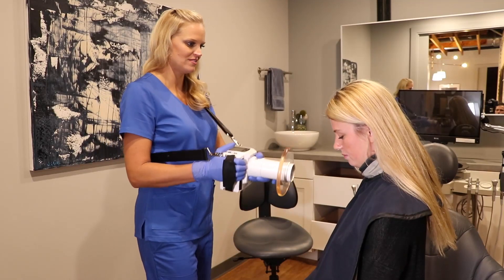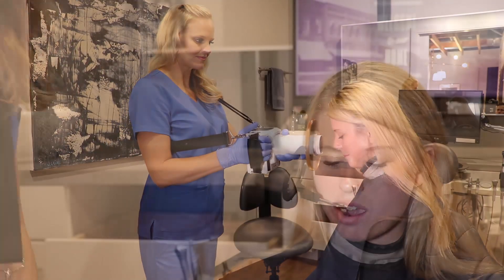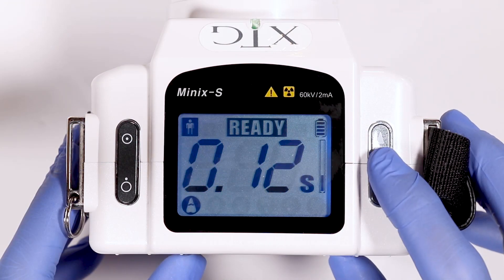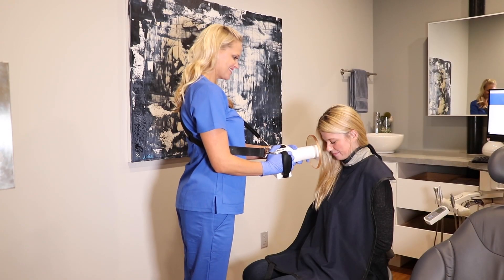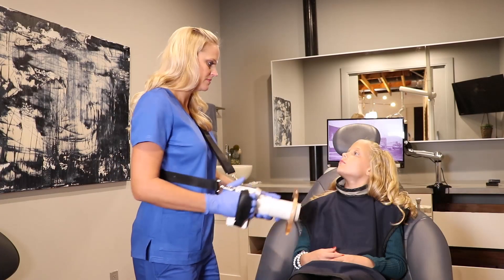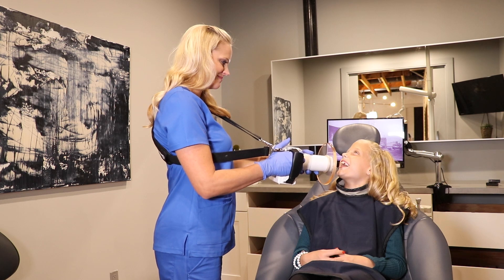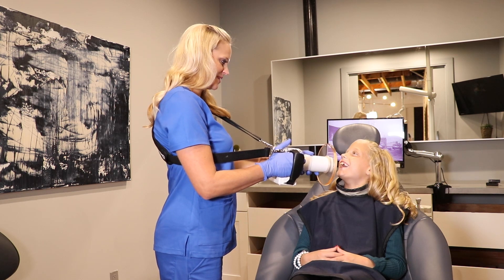The XTG provides your office with a new patient experience. This unit allows the operator to stay in the room with the patient. Explain to the patient that your office invests in technology that is safe, allowing the operator to now stay in the room while taking x-rays. Efficiency is important to both the patient and the office, as this device will save you time taking your series of x-rays.